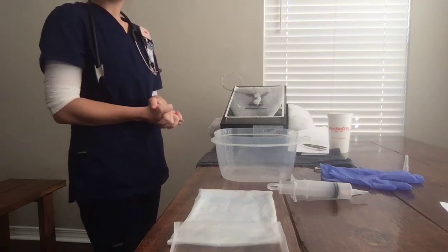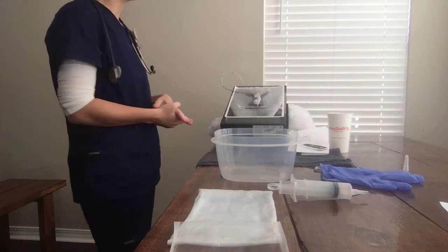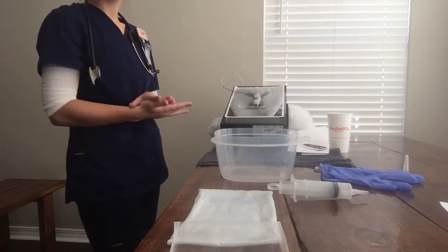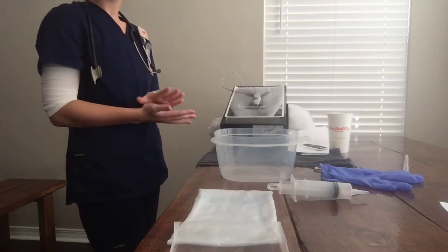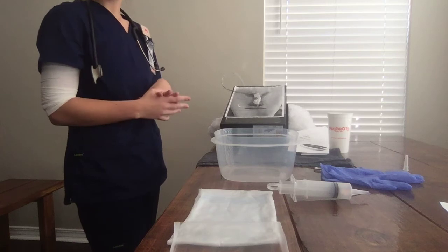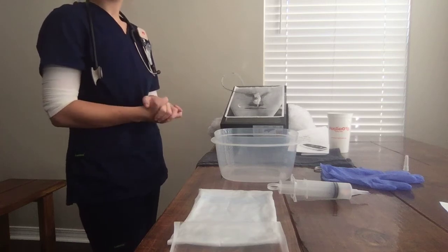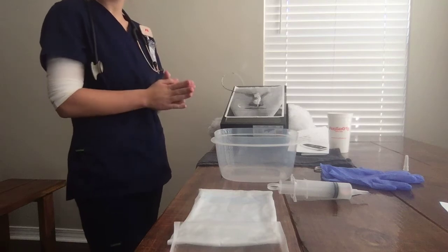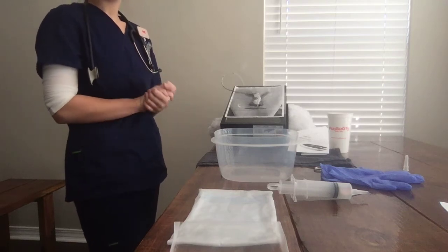When I document, I would do the type and the size of the tube. I would do the location, how it's secured, how I verified placement, the type of suction, so it's low intermittent. I would do the patient's tolerance, the procedure, the color, amount, and consistency of secretions. And so now we are going to remove it.